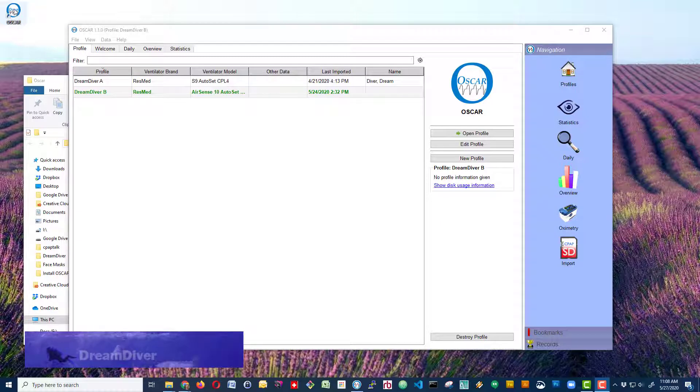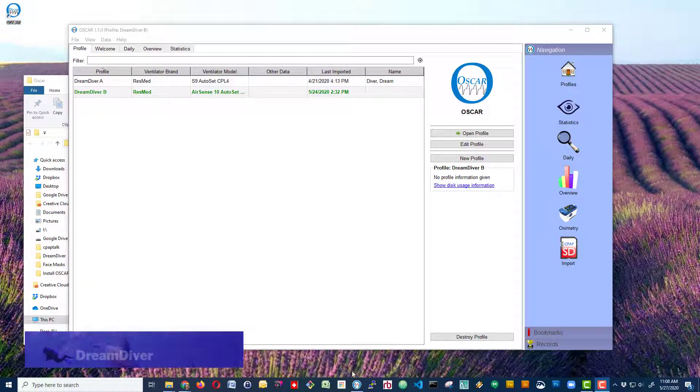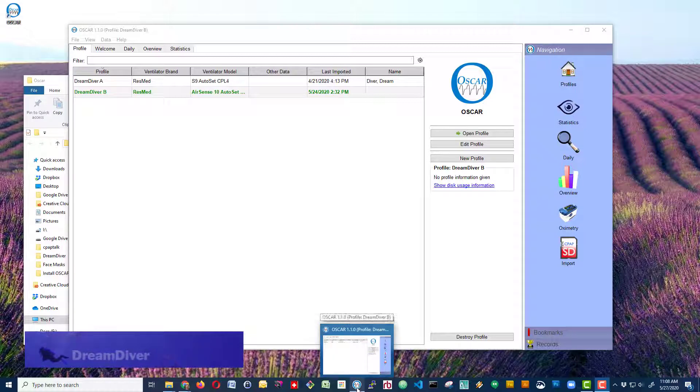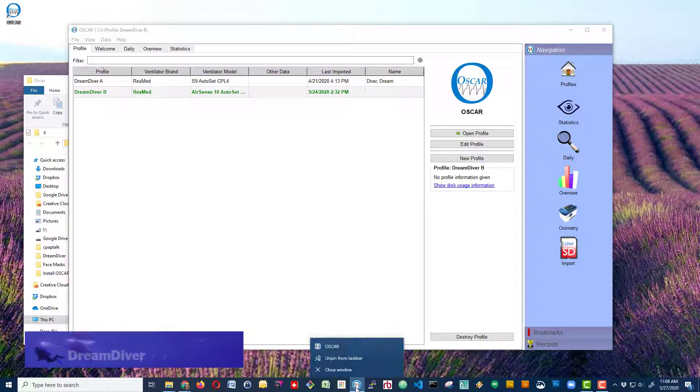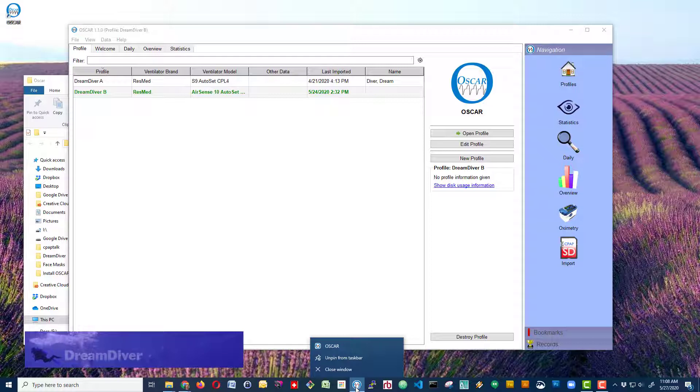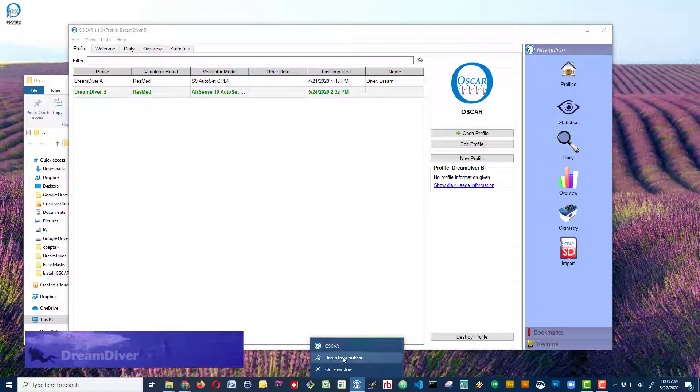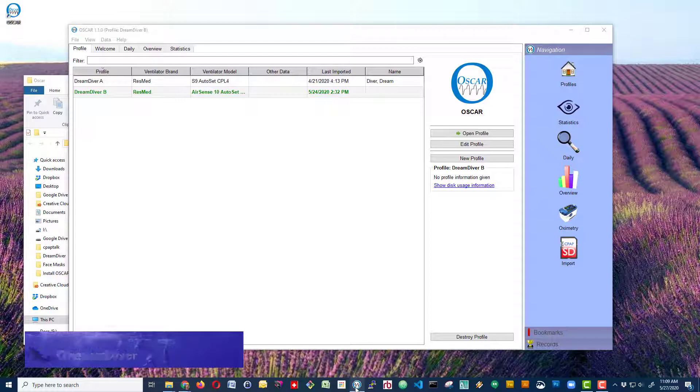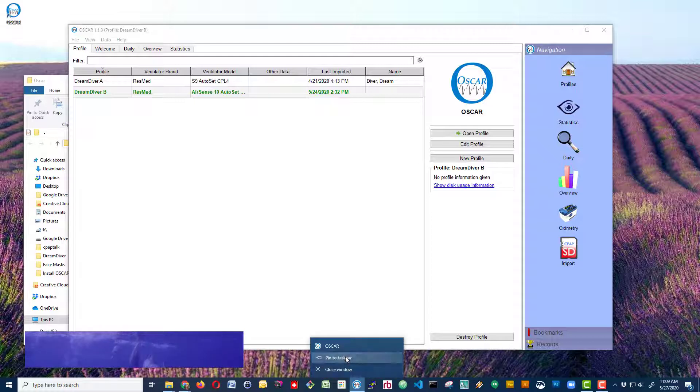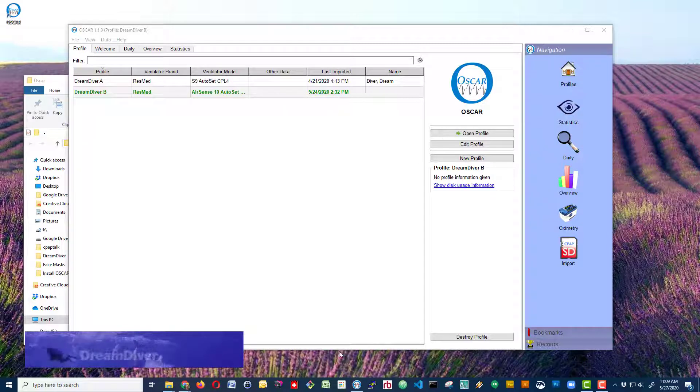We can either double-click on this to launch OSCAR every time, or since it's currently installed and launched, we can right-click on the OSCAR in the taskbar and pin it to the taskbar. I've already got it pinned, so it's just a case of right-clicking and pinning it to the taskbar.